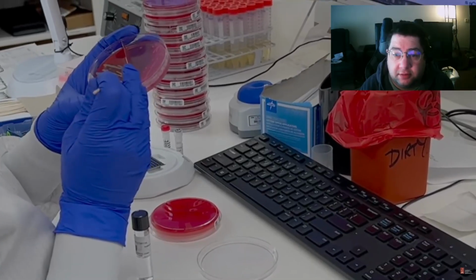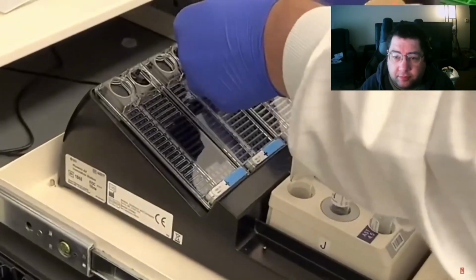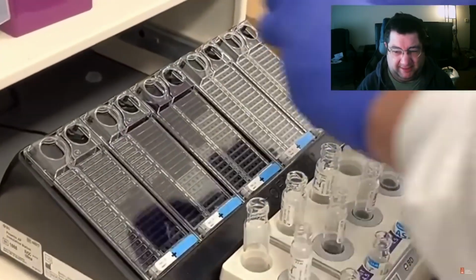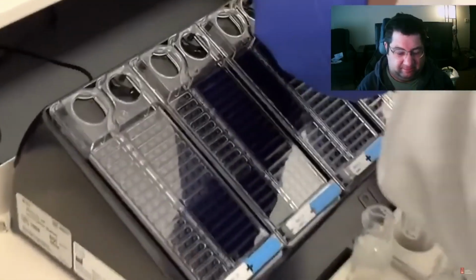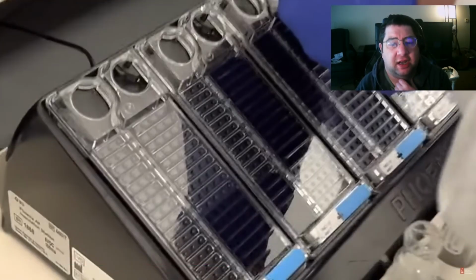Antimicrobial susceptibility testing, or AST, is performed to guide clinicians in choosing the right antibiotic for a particular infection. This test provides information about the efficiency of... So that's the BD Phoenix, Becton Dickinson.